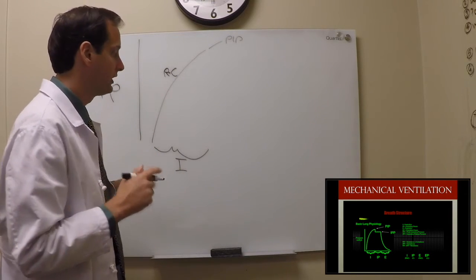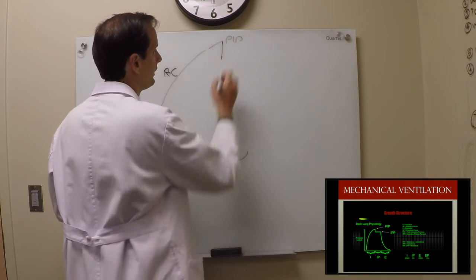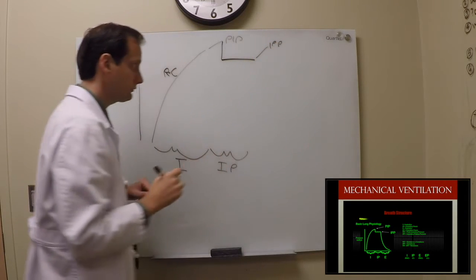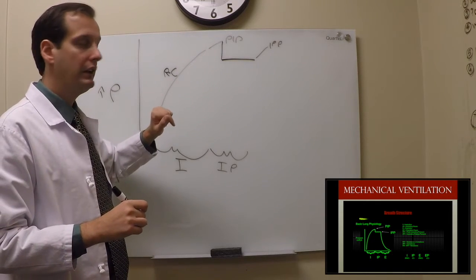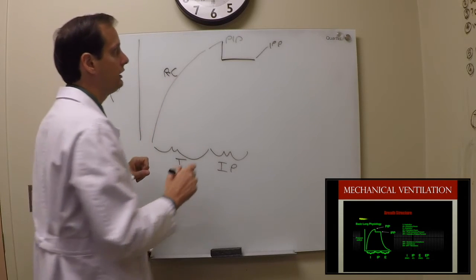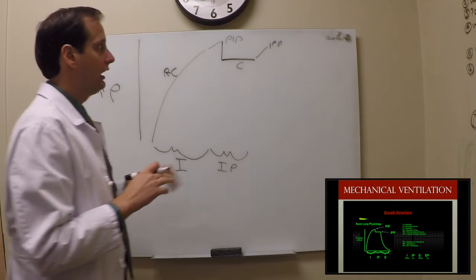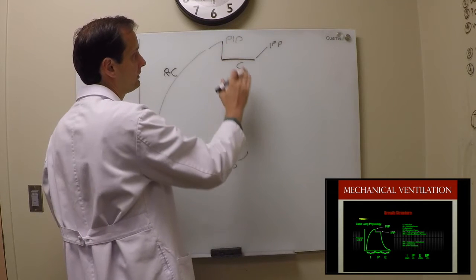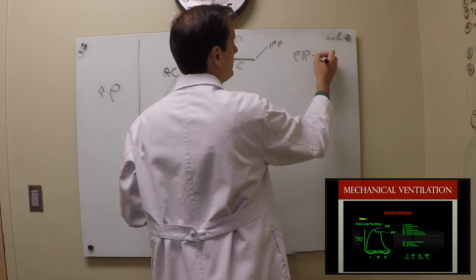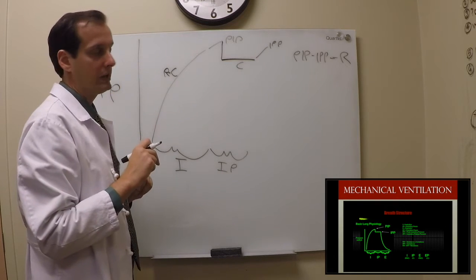If I then perform what's called an inspiratory pause, you will find that the pressure drops and you end up with an inspiratory plateau. Because I am holding my breath and air is not moving, there is no resistance to air movement. As a result, resistance fades away and you are left with what is representing just compliance, or compliance isolated. And therefore, if you look at the difference between your peak inspiratory pressure and your inspiratory plateau pressure, your PIP minus your IPP, should give you, or should represent, the resistance by itself.